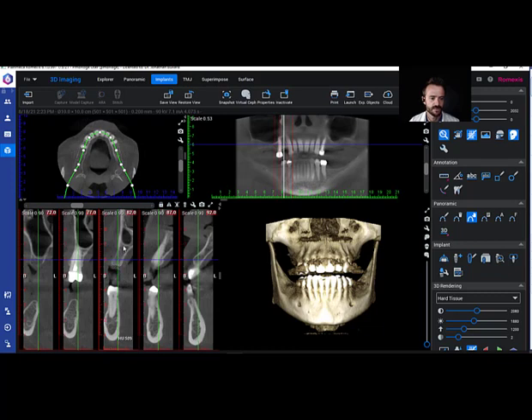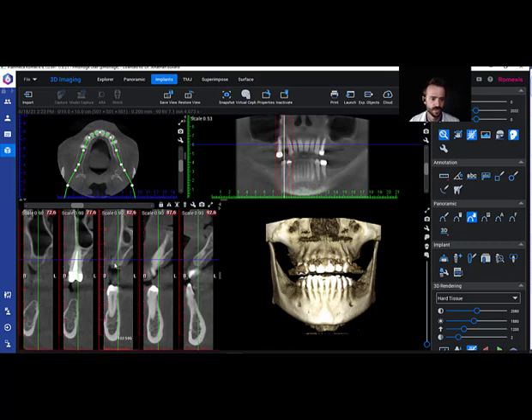We can see the height of the ridge, and I would very easily be able to assess the amount of bone and the quality of bone that's present.